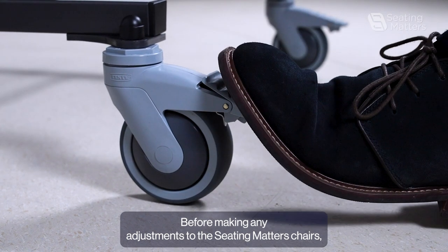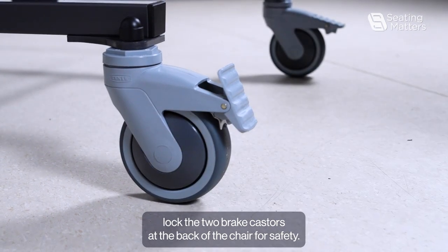Before making any adjustments to the Seat Matters chairs, lock the two brake casters at the back of the chair for safety.